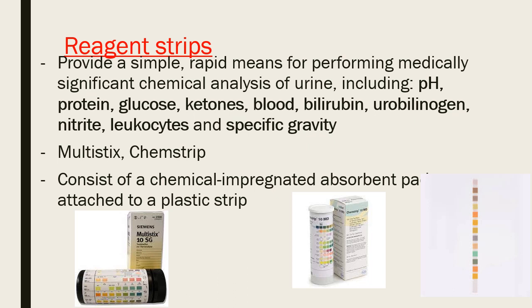The reactions are interpreted by comparing the color produced on the pad with a chart supplied by the manufacturer. That is your comparator block.